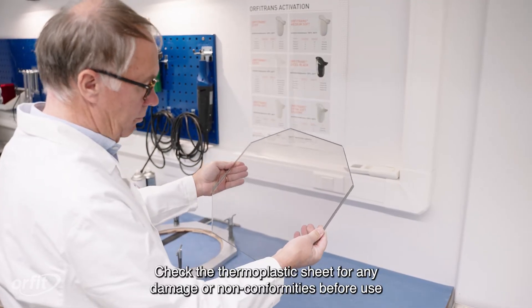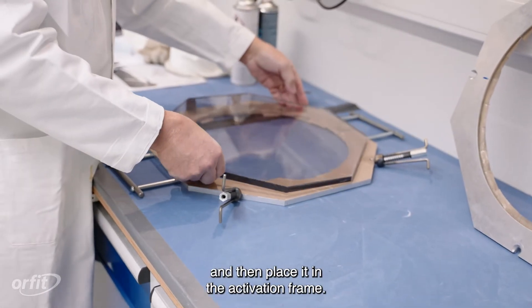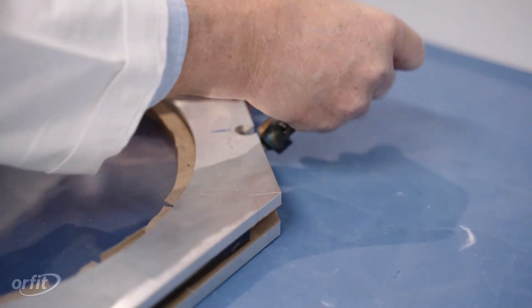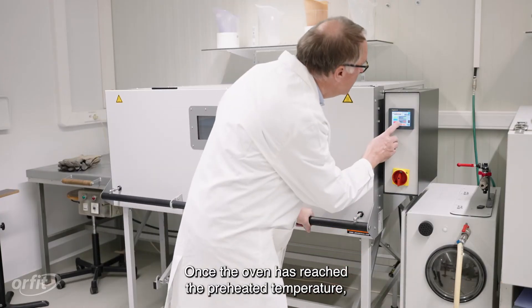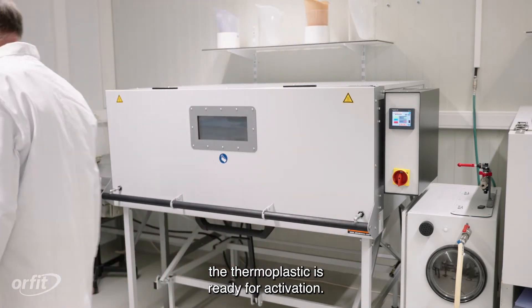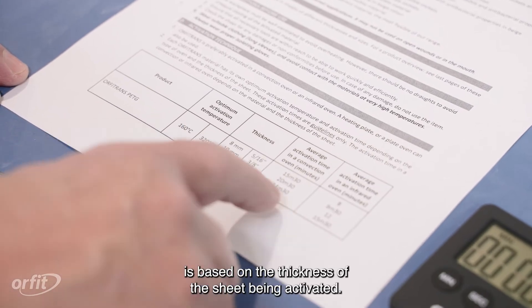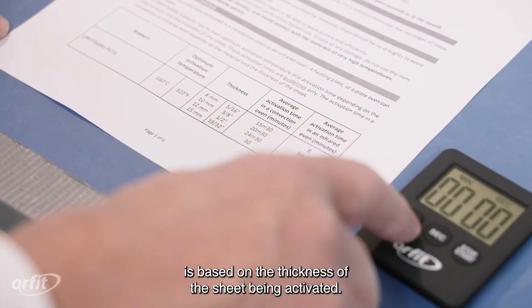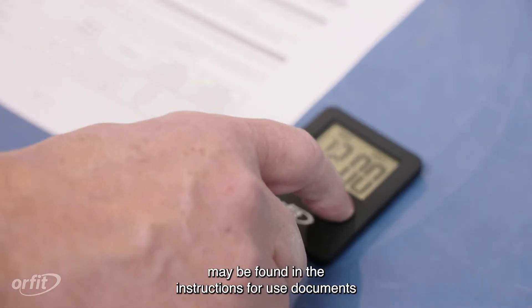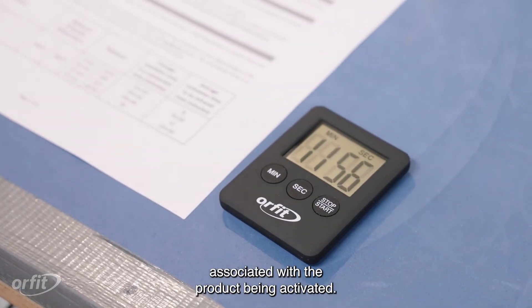Check the thermoplastic sheet for any damage or non-conformities before use, and then place it in the activation frame. If damaged, do not use. Once the oven has reached the preheated temperature, the thermoplastic is ready for activation. The optimum activation times for Orphatrans PETG are based on the thickness of the sheet being activated. Recommendations for activation times and temperatures may be found in the instructions for use documents associated with the product being activated.